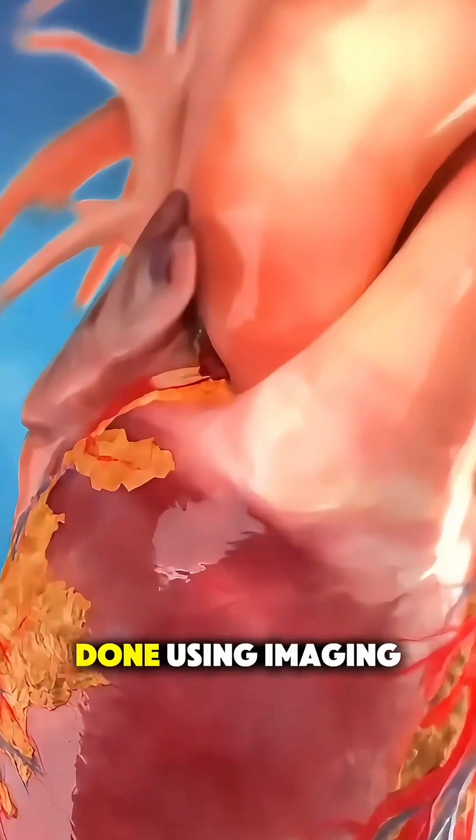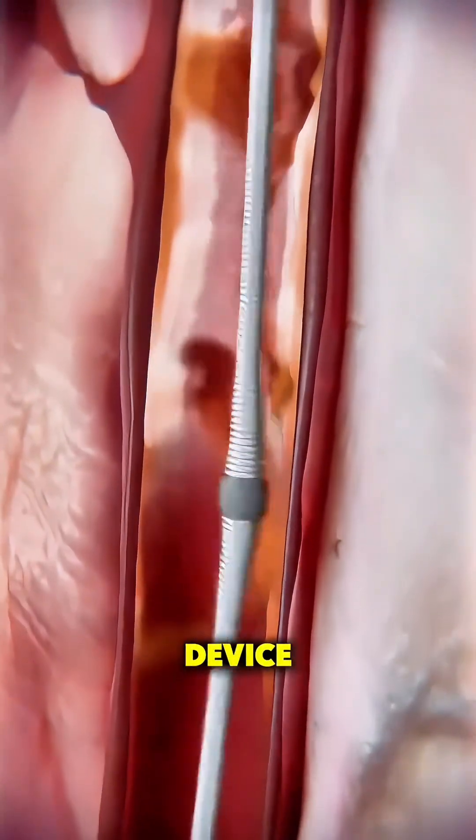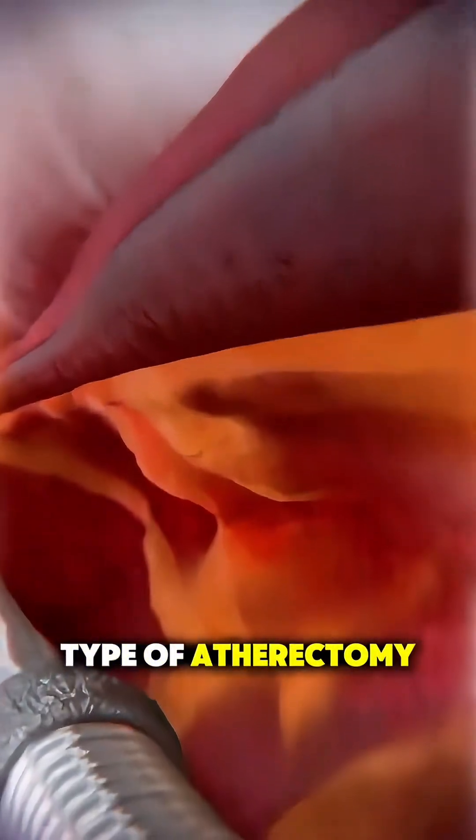This is all done using imaging so they can see exactly where they're going. At the tip of that catheter is a special device which may spin, shave, or laser away the built-up plaque, depending on the type of atherectomy being used.